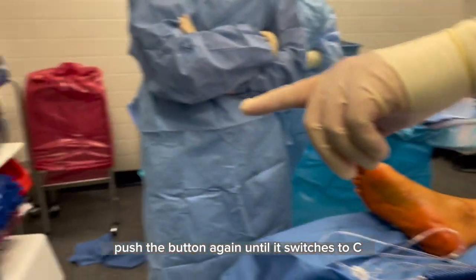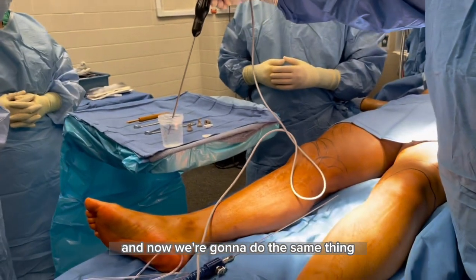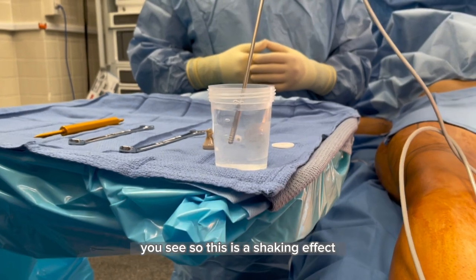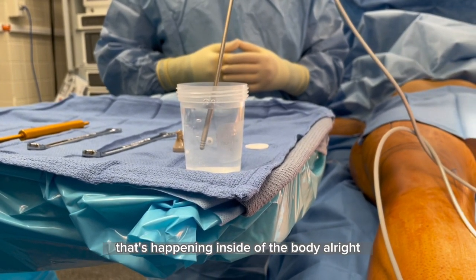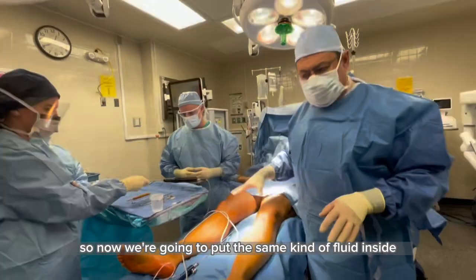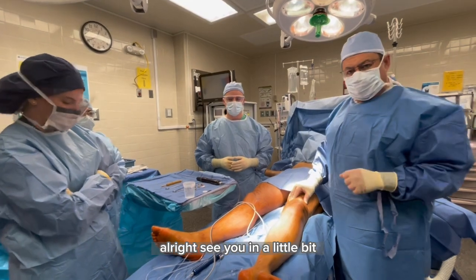Push the button again until it switches to C. Now we're going to do the same thing, and you can see that it continues. So this is a shaking effect that's happening inside of the body. Now we're going to put the same kind of fluid inside, shake it, and I'll show you what kind of result we're going to get.